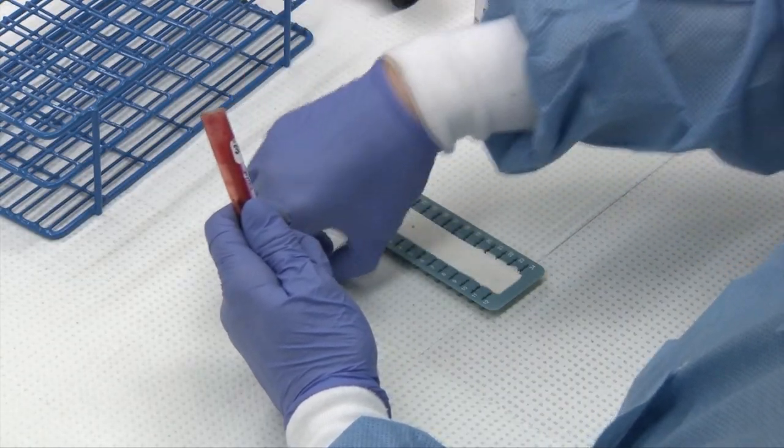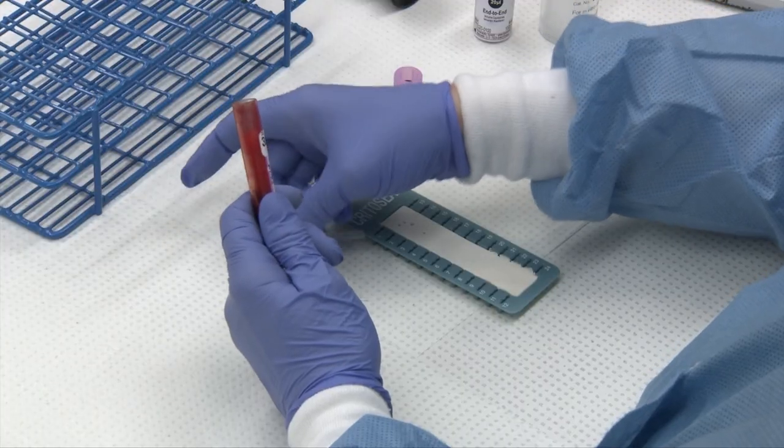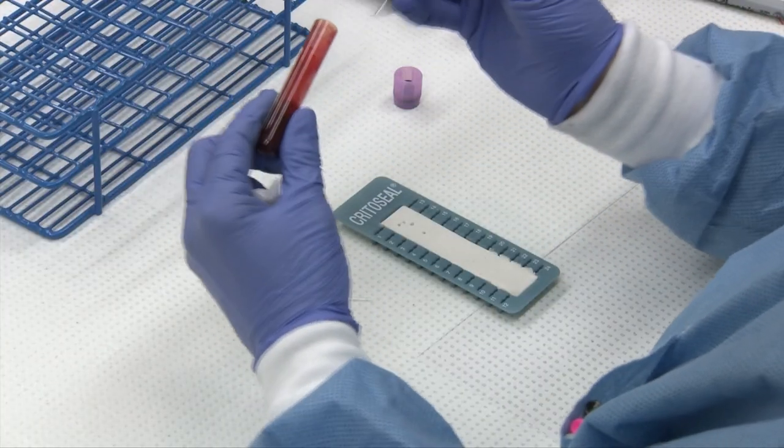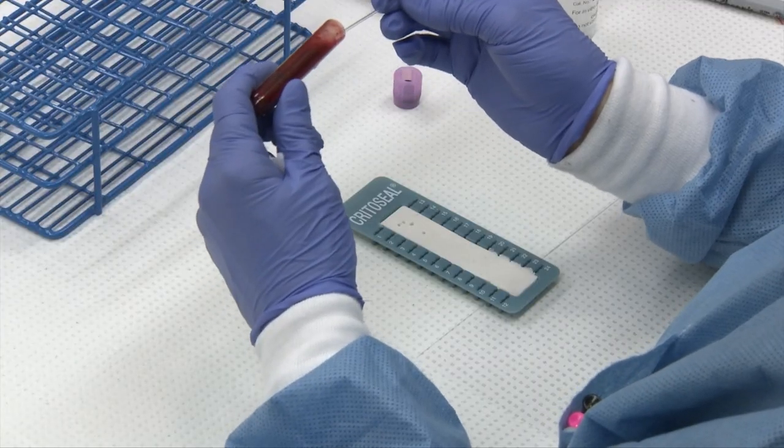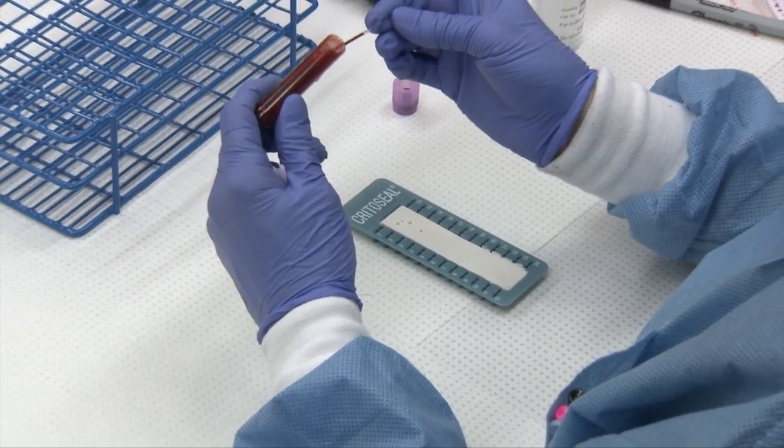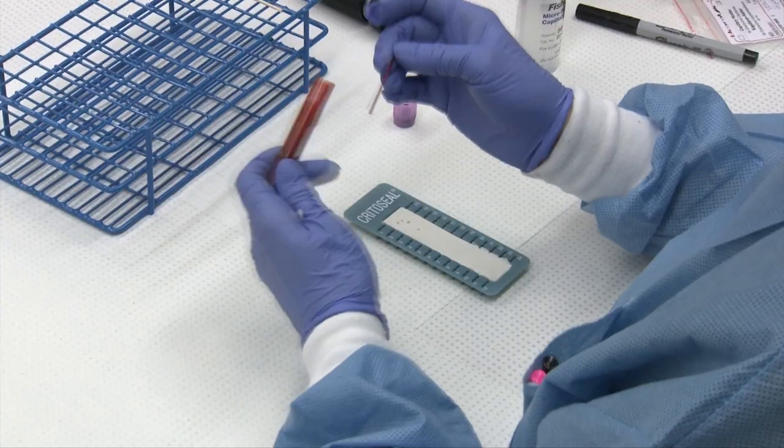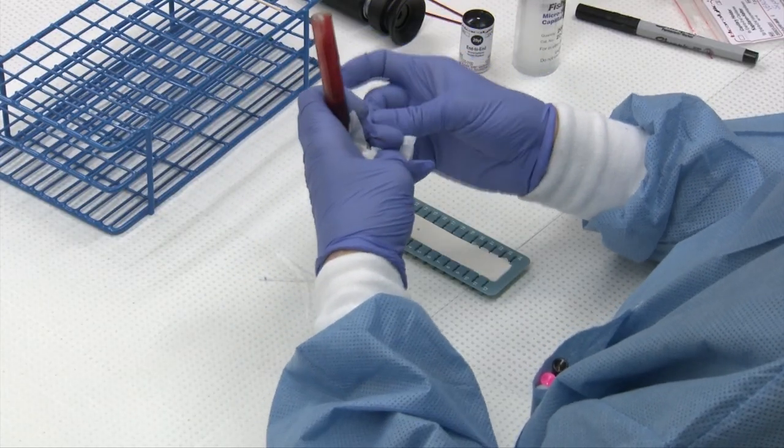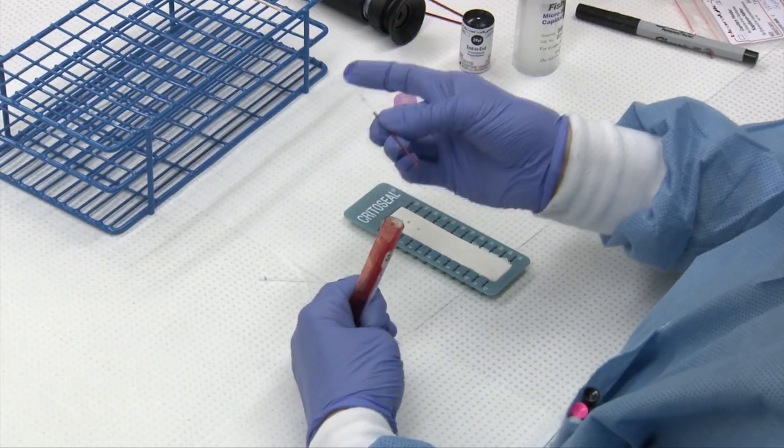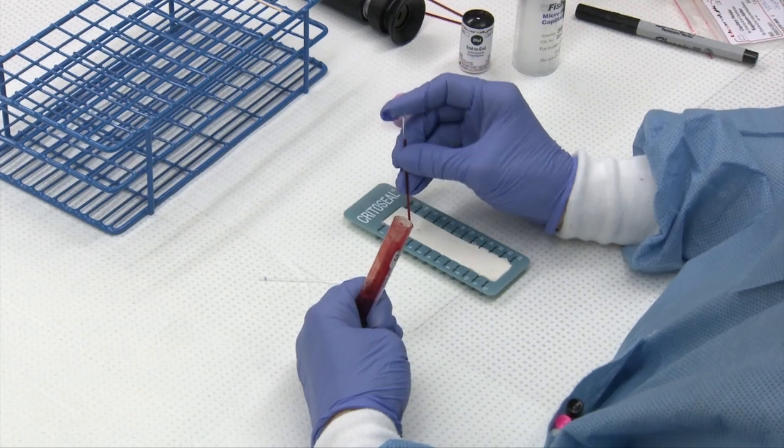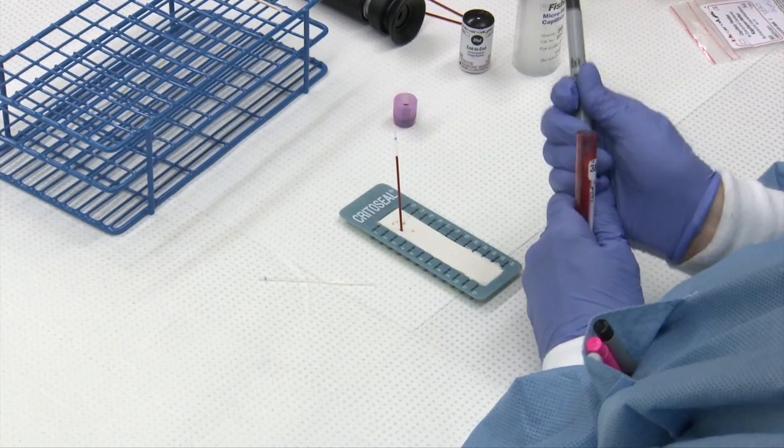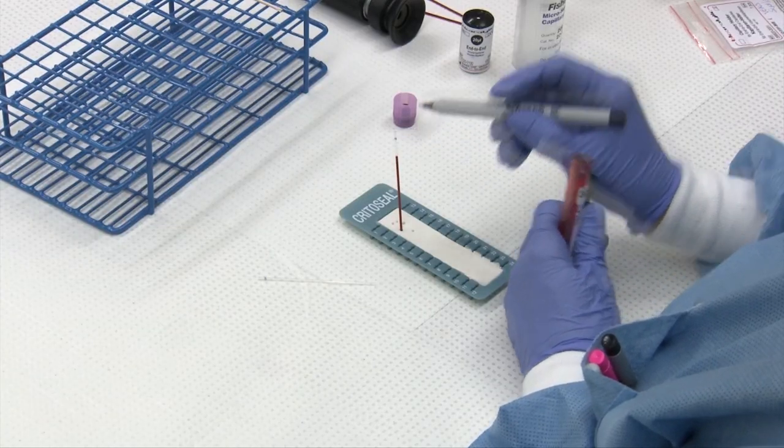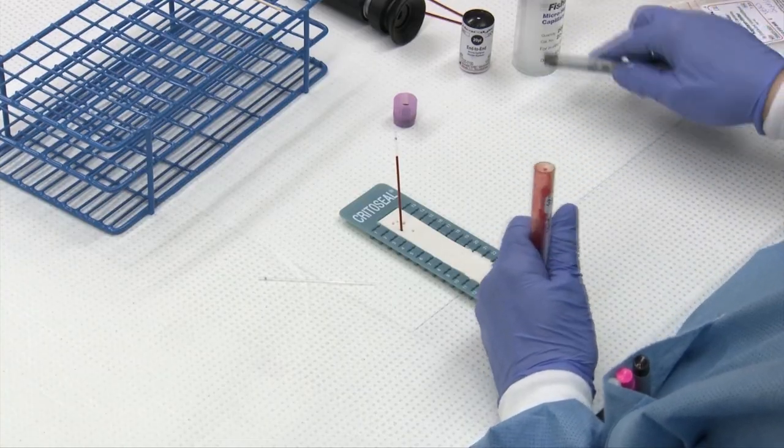Fill two PCV tubes about three-quarters full. If you're having trouble filling your tube, let gravity be your friend. There is no right or wrong end to these tubes even though one is marked with a blue line. I recommend not filling your tube right to that blue line because it makes it more difficult to read your PCV.